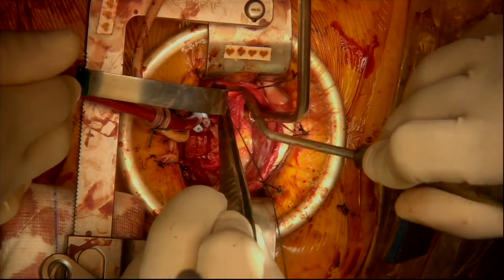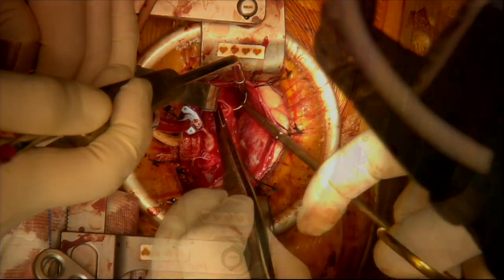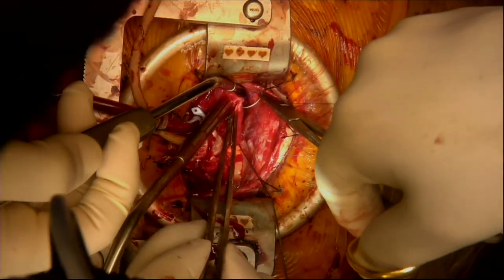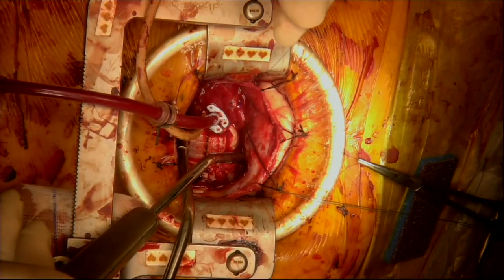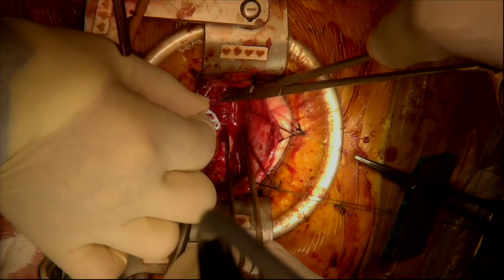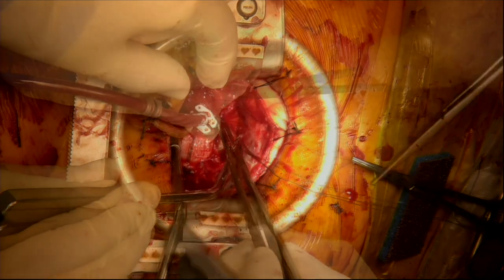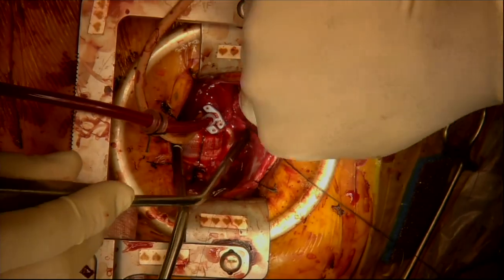Gentle retraction of the aorta and the graft to one side allows access for inspection and repair of the pulmonary trunk. This is done with a two-layer continuous suture technique.